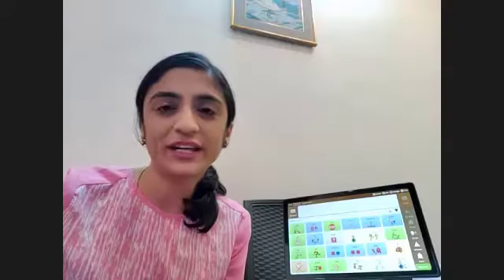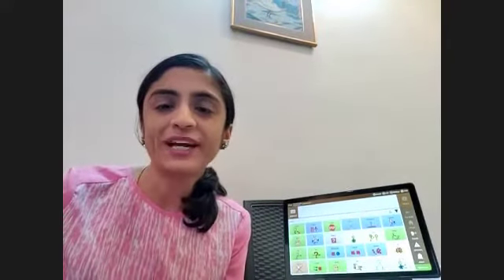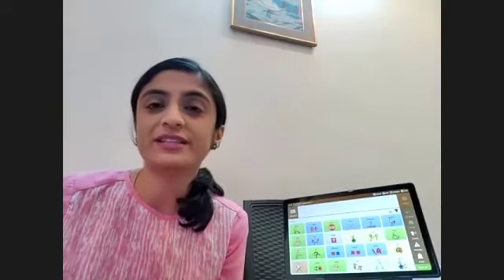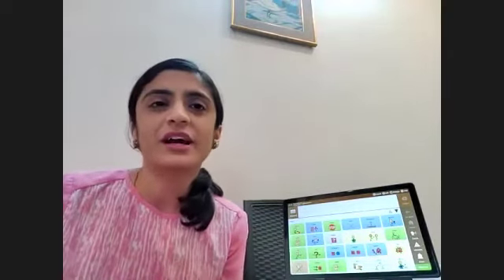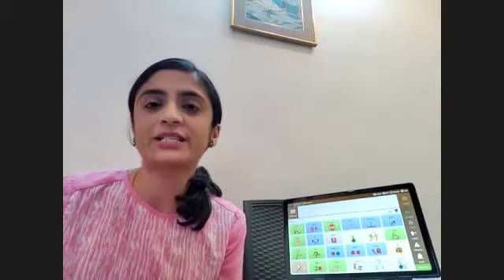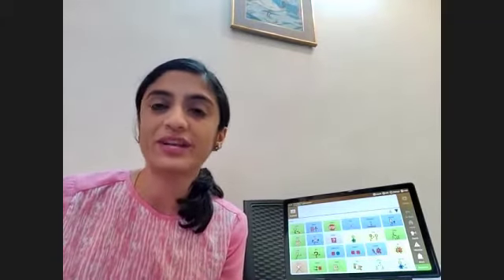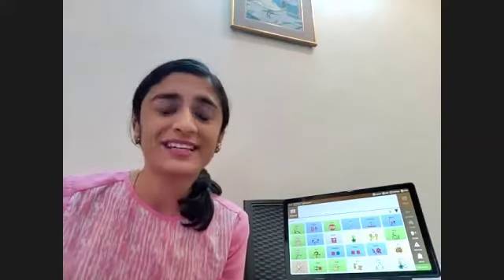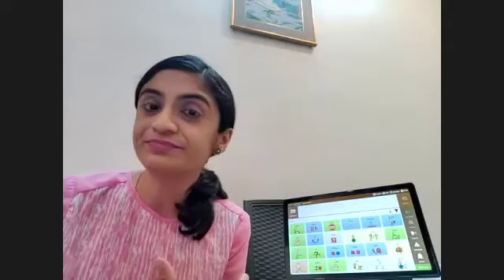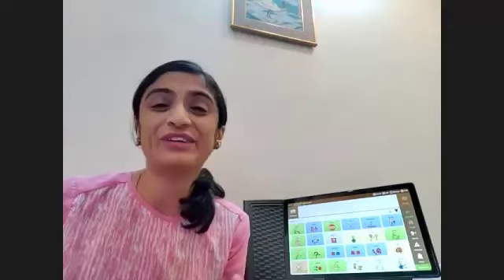So Riddhi has asked a question, how to encourage the child to use Avaz app? Okay, thank you for that question. I think in the beginning, it would be really good to start with something that's motivating for them. So that's why when we start teaching with the Avaz, we try to use it for requesting for their needs or things that they really want. So for example, it could even be like a favorite cartoon, or it could be a favorite food item.